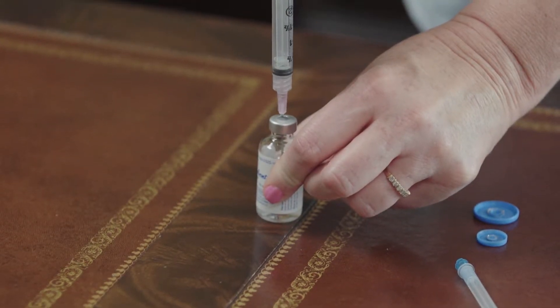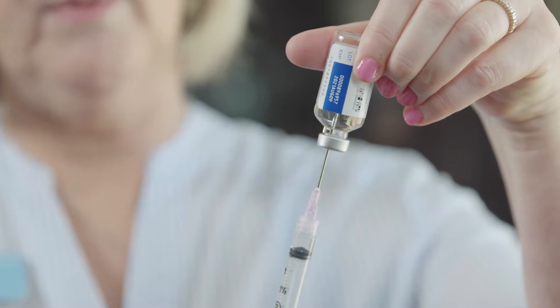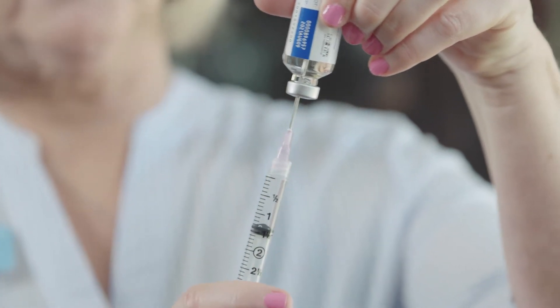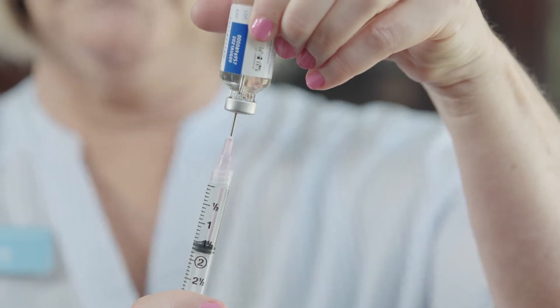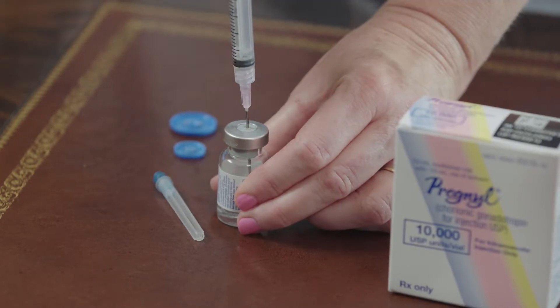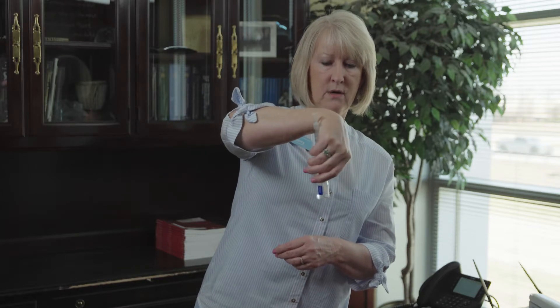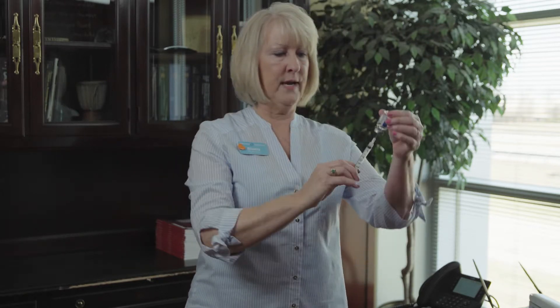Take your liquid, push the needle in and inject the air. Turn the vial over making sure the tip of the needle is in the liquid, then pull down on the plunger until the top of the black stopper is at the one and one half mil mark. Turn the vial over, take your needle out and inject one and one half ml of liquid in with the powder. You may have to twirl the vial to get the powder fully dissolved. Once it is dissolved, turn the vial over.